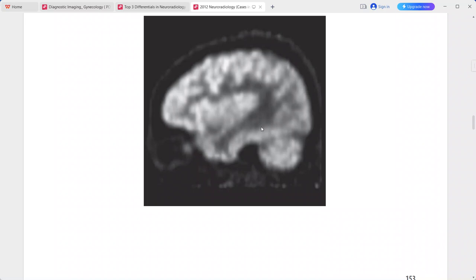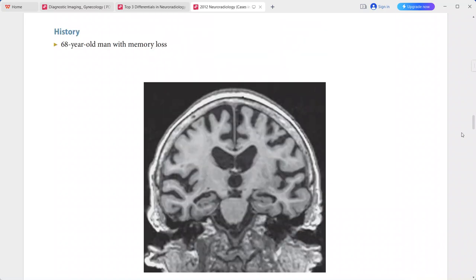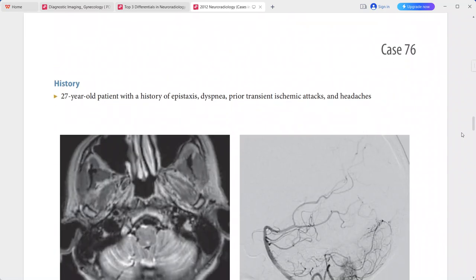This is a typical case of Alzheimer's disease. These imaging findings are quite typical for Alzheimer's disease, and you have to differentiate it from other causes of dementia such as vascular dementia and frontotemporal dementia. Early recognition is important for starting treatment immediately.